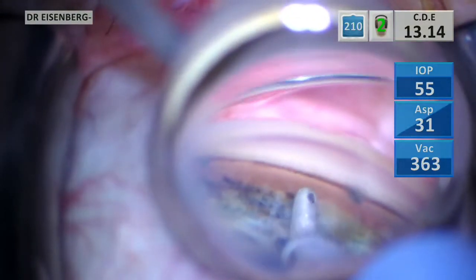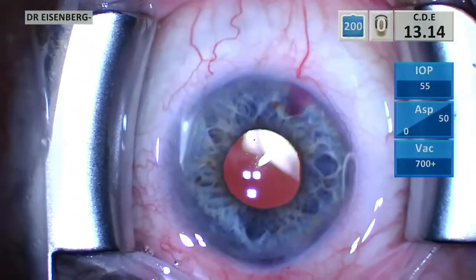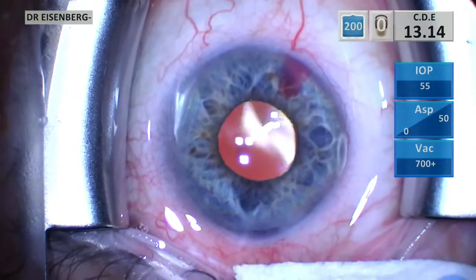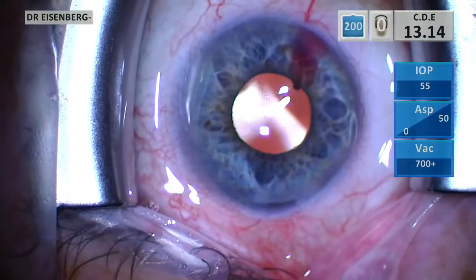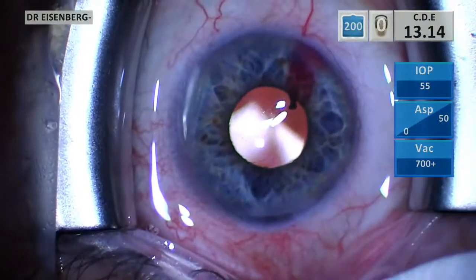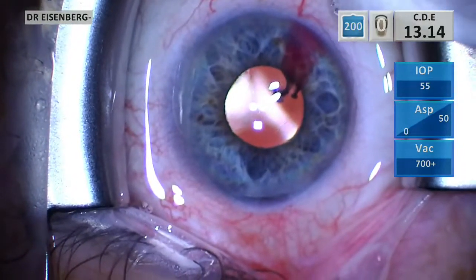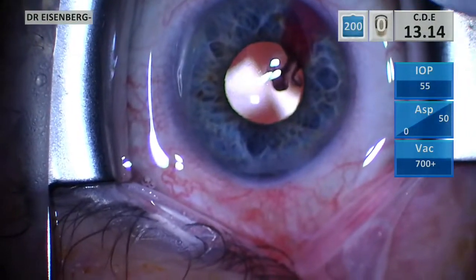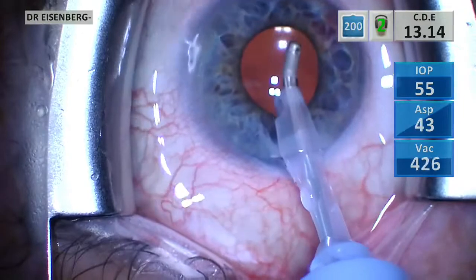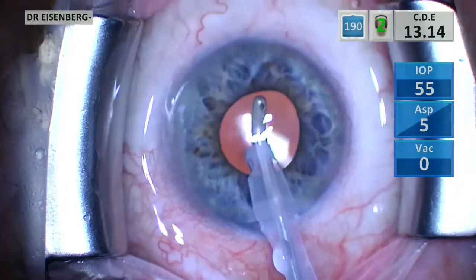I like to clear it out, and here, clearing out the rest of it. Both stents are looking really great. Then I bring the eye back to neutral, and there's our perforating vein right there — you can see how it's doing a beautiful job of refluxing back into the eye. On the other side of the eye is just a regular scleral vein. In a minute, I'm going to show you proof of this — one's a perforator and one is a scleral. That's a lot of reflux, so I'm going to go in and clear some of that out and pressurize the eye.